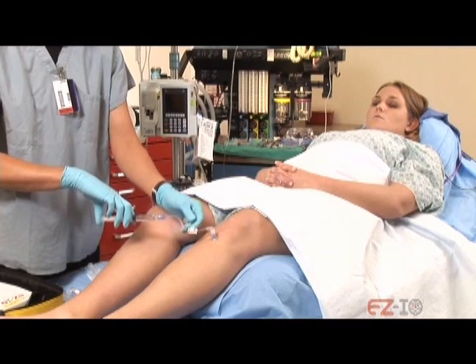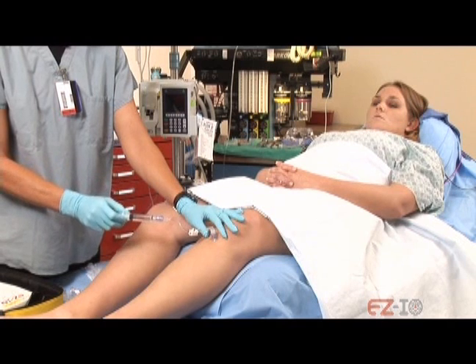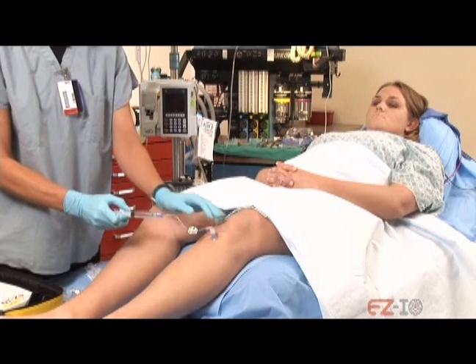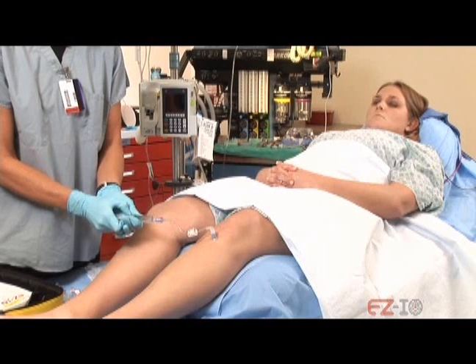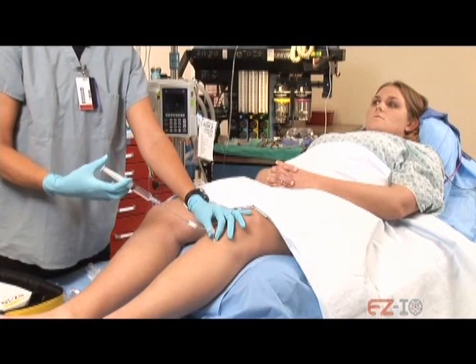Now again, we're just going to go slowly here. Doing okay? Mm-hmm. Still doing okay? What's your pain level on a scale of 1 to 10? Like a 4. Okay.